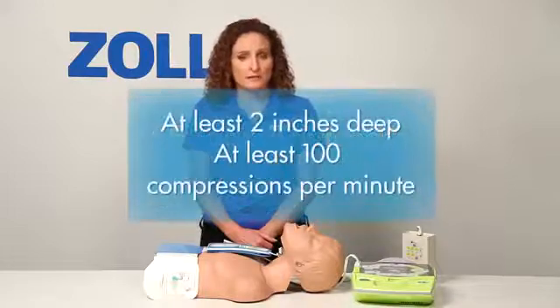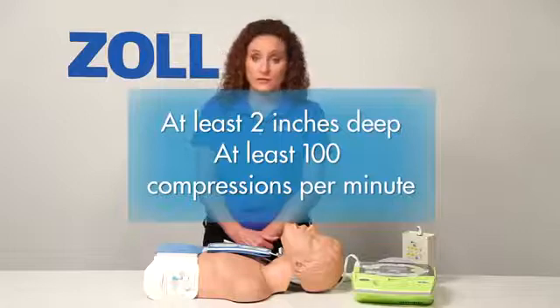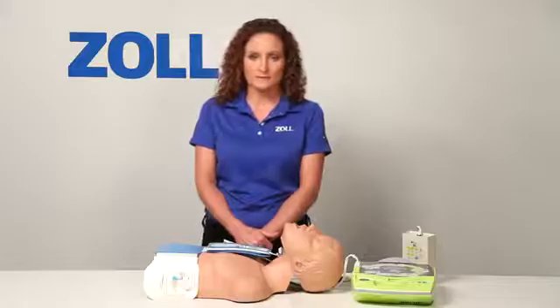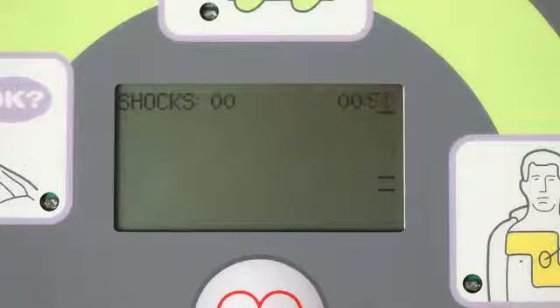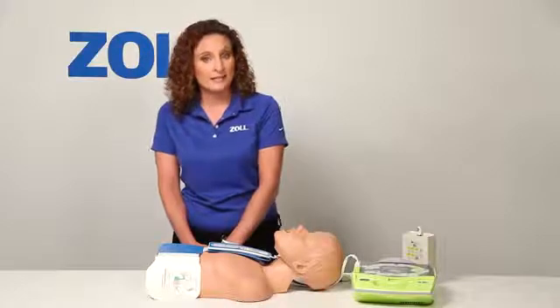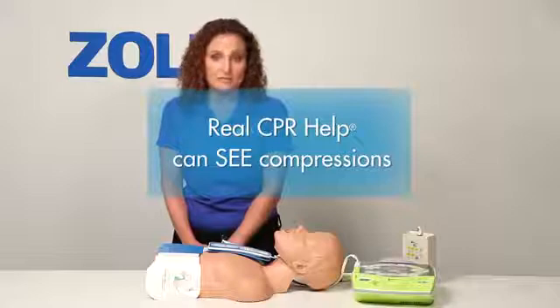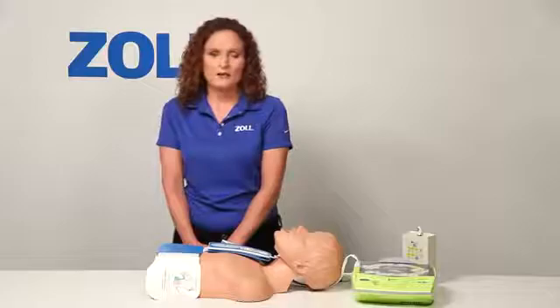Half of all rescues with an AED start with no shock advised. Perform good CPR with chest compressions that are at least 2 inches deep at a rate of 100 compressions per minute, and the next analysis may tell you to deliver a shock. The AED Plus repeats the prompt to start CPR every 10 seconds because it has a technology called Real CPR Help. The AED Plus sees that I've not yet begun chest compressions, and when I do start CPR, it will see my chest compressions and help me do good CPR in a way that no other AED can.